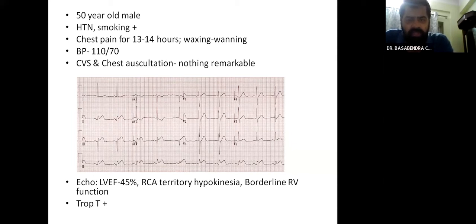As we can see, the ECG showed that the patient had an acute inferior wall ST elevation MI, and his presentation was a bit delayed. There were significant Q waves already developed in the inferior leads, and as far as the ECG interpretation went, we were of the opinion that it was right coronary artery involvement.